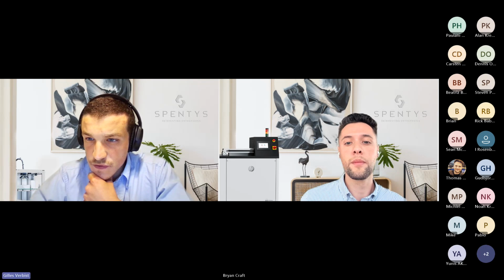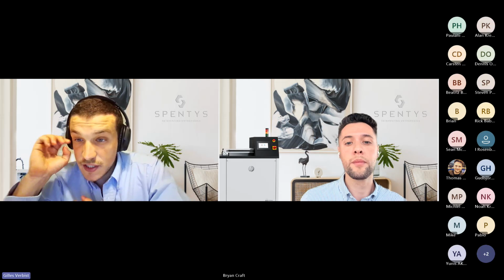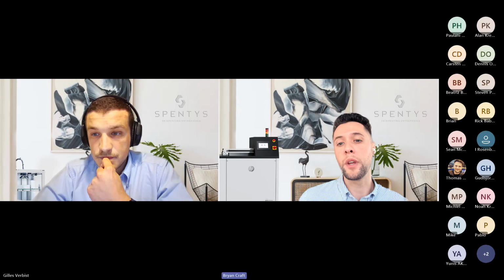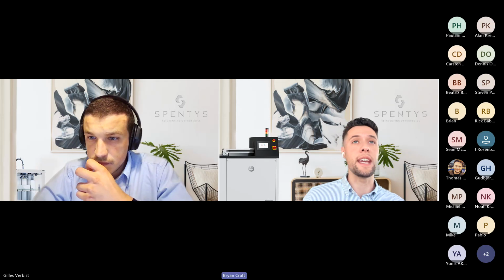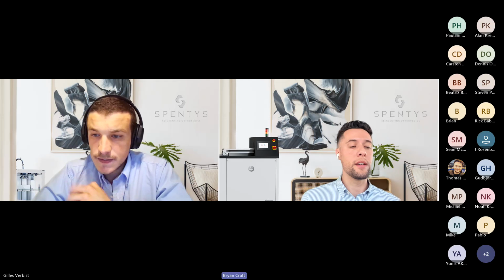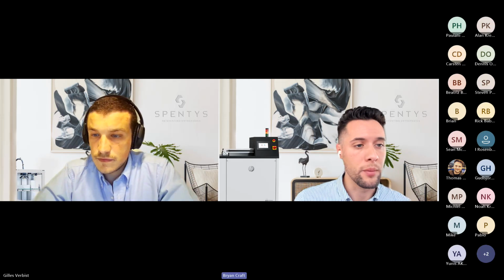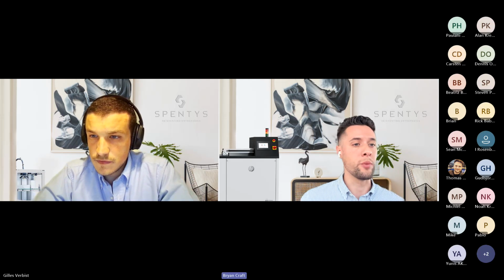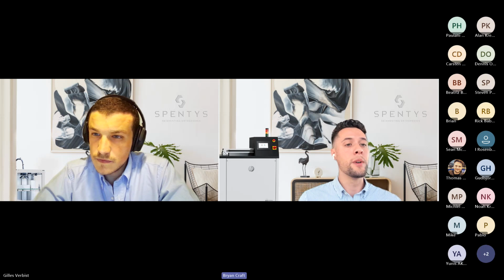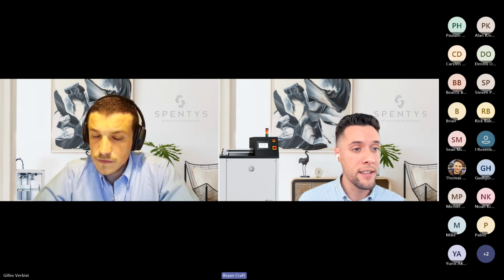Any upcoming options for KAFO modifications? That's a great question. We don't have KAFO specifically in our roadmap. Not to say that we won't do it. Our partners are really dictating the direction of where we're going. And currently at the moment, we're focused on AFO, some prosthetics, and we can always add KAFO.